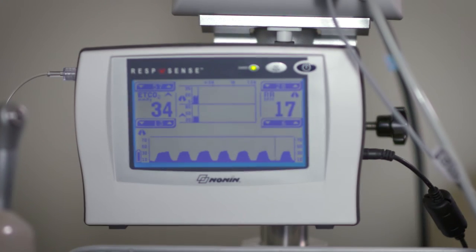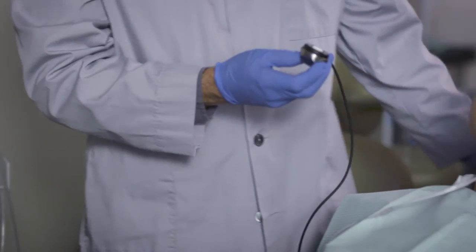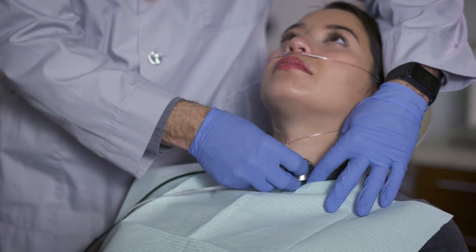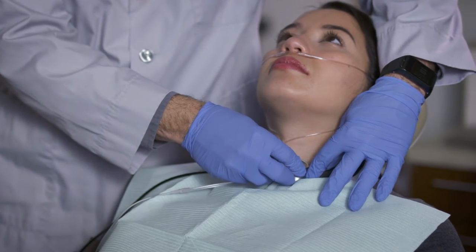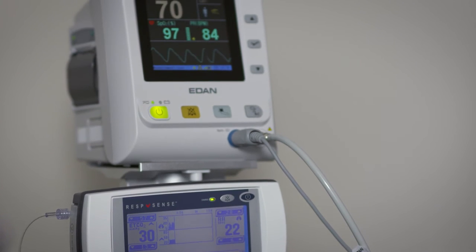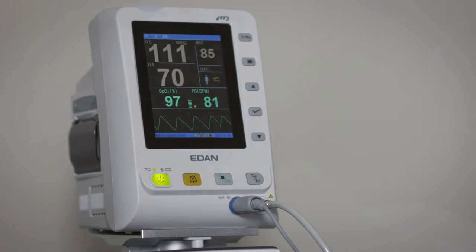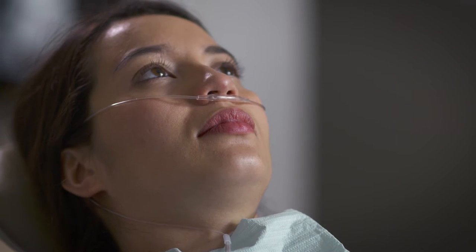By adding a standalone capnography monitor and a Bluetooth stethoscope to the existing parameters you may already have in your clinic such as pulse oximetry, blood pressure, and heart rate, you will be meeting the new ADA recommended guidelines for ventilation and circulation of moderately sedated patients.